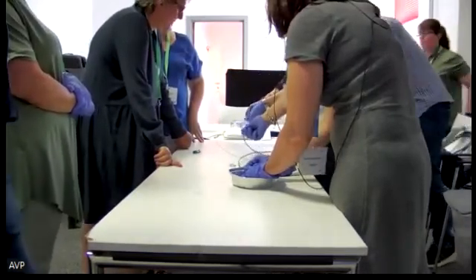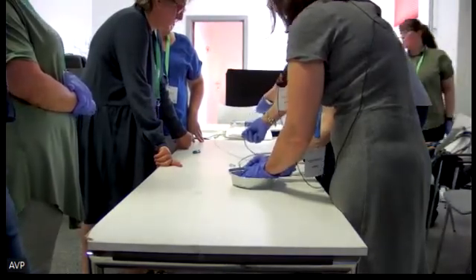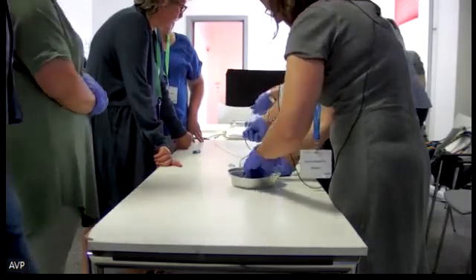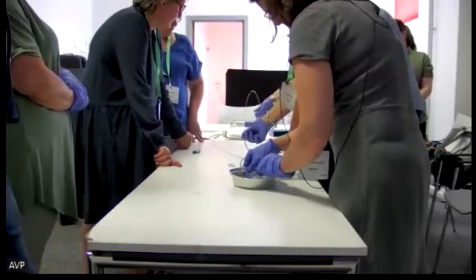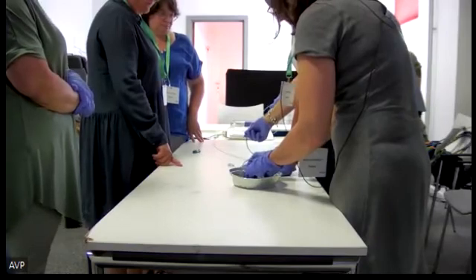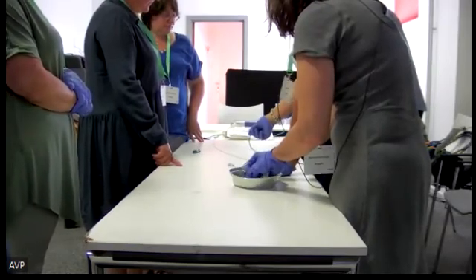Therefore, we have to push the guide wire and remove the inner sheath, the white one. Push the wire, please. And in this big catheter, we can place the second wire.